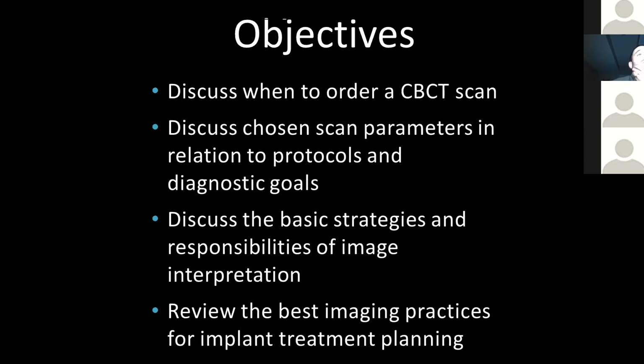Yes, so by convention, coronal is you are looking at the patient as if you're staring them in the face, and you're just taking a selected slice in that patient orientation, more towards the anterior or more towards the posterior. And if you're looking at a cone beam CT scan or even an MRI or medical CT scan, you can look for the R and L tags, right and left, to keep yourself oriented in that manner.